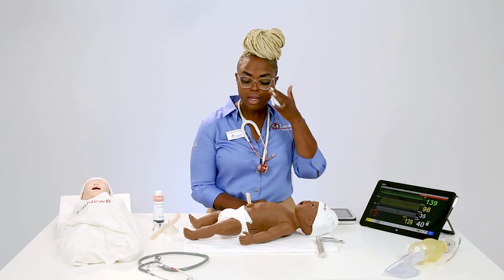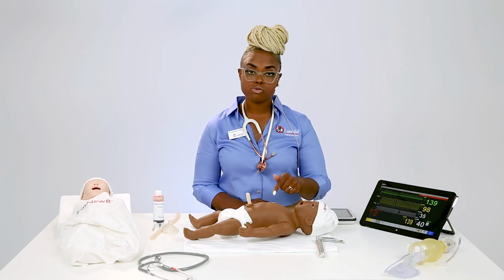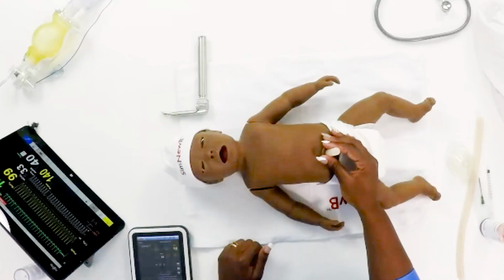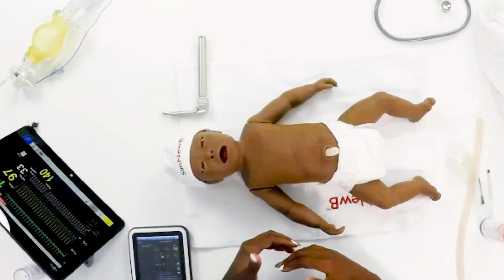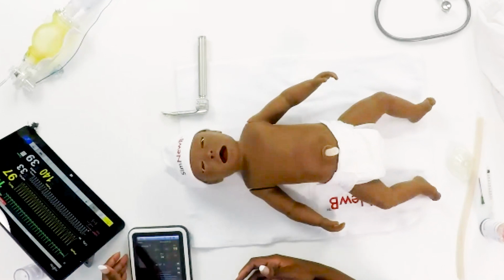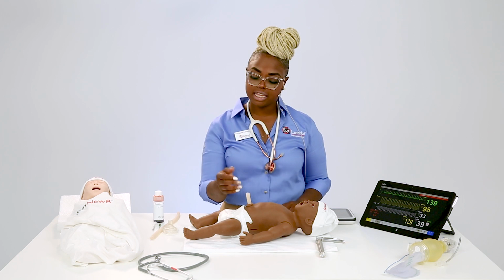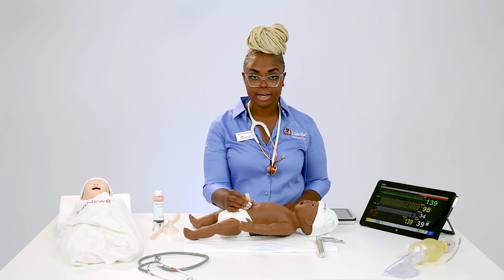Thanks for showing that. Next question, can you state again what 3 pulse sites are available? Absolutely. So again, we have the bilateral brachial, so one on the left, one on the right, and also the umbilical cord. If you palpate those bilateral pulses, you will get feedback recognition into your Simpad to show you that the pulses are being palpated, and then also the umbilical pulses here as well.